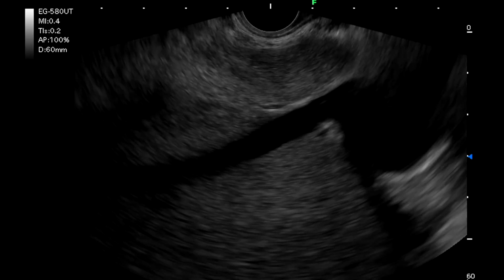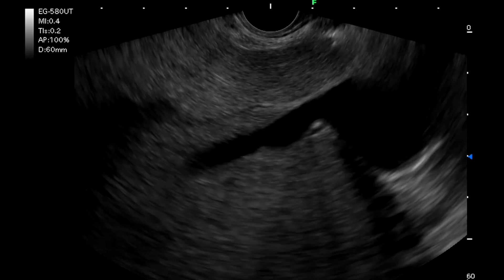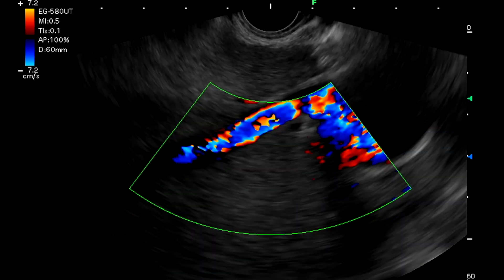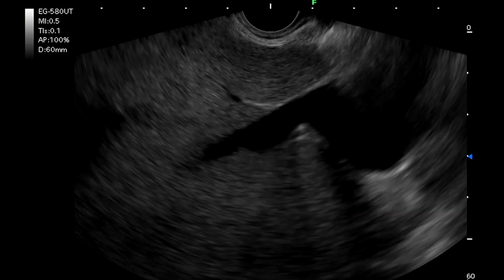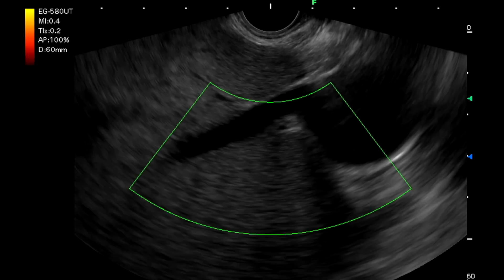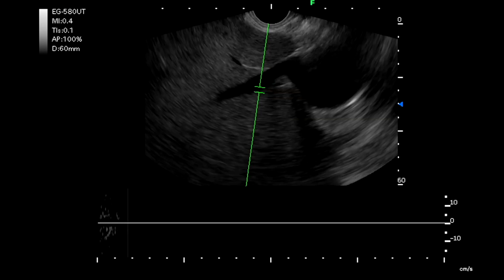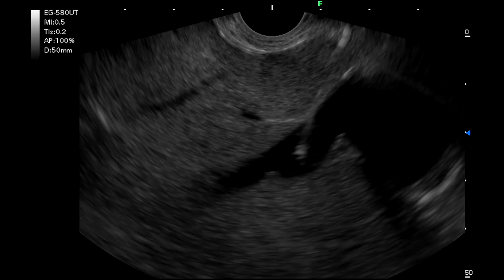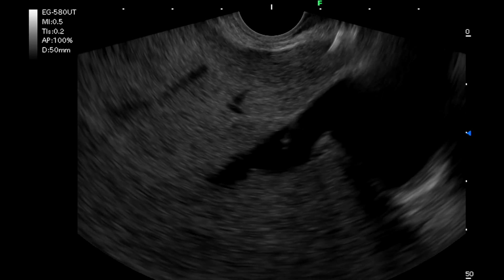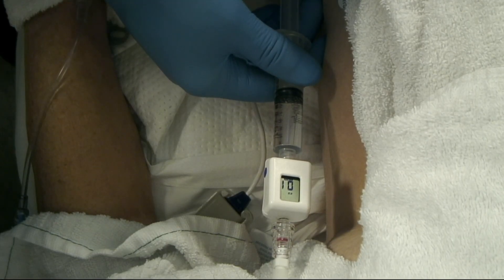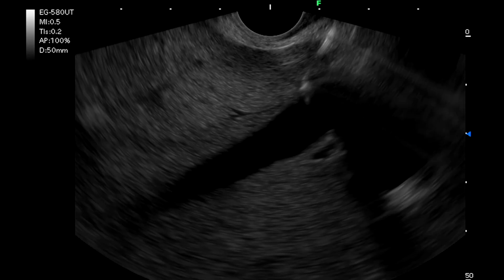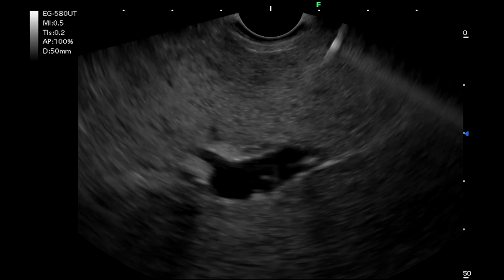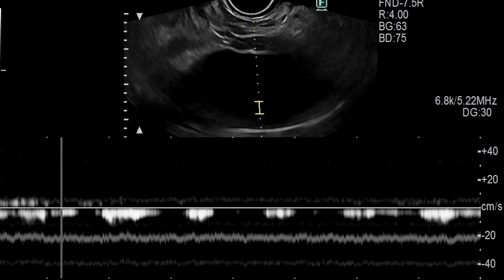This 52-year-old female with non-alcoholic fatty liver disease was referred for evaluation of suspected cirrhosis. At EUS, the mid-hepatic vein, with its characteristic thin anechoic walls, was identified as it joined the inferior vena cava. Pulse wave Doppler revealed the four-phase pattern classic for hepatic vein. The vessel was punctured, and after infusion of one milliliter of saline, three pressure measurements were obtained. The average reading in this patient was 15 mmHg. The needle was slowly withdrawn, and the portal vein was identified by its characteristic thick wall and continuous vascular flow.